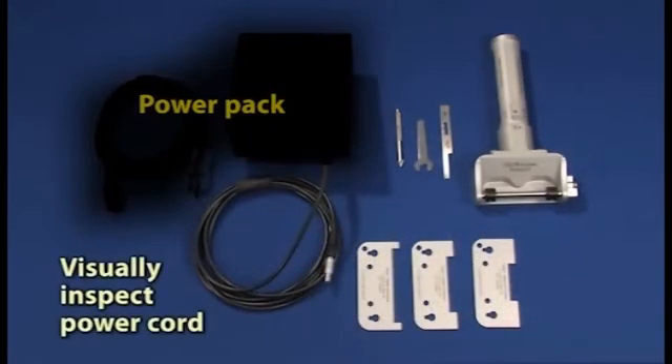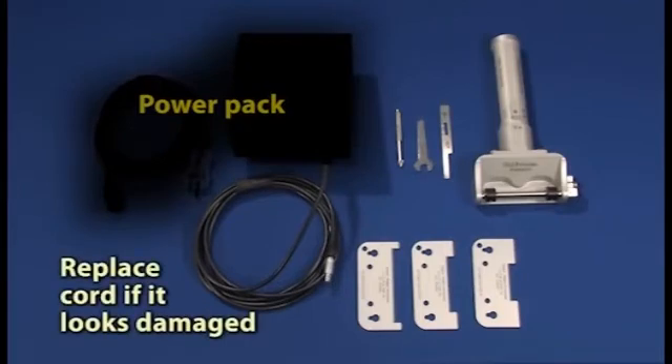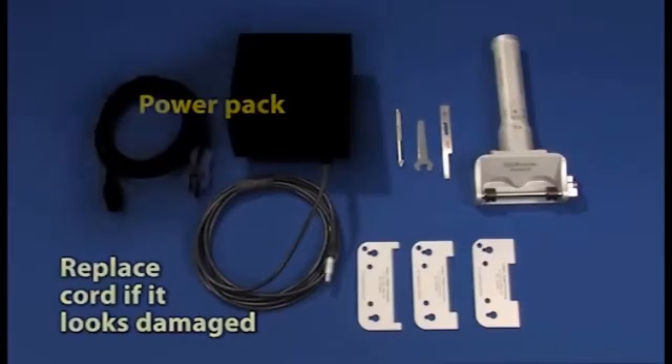Visually inspect the dermatome's power cord for signs of damage. That may include cracks or discoloration of the cable jacket, exposed conductors, or distortion of the cord or connector. If damage is observed, do not use the dermatome. Contact Integra customer service to order a replacement cord.